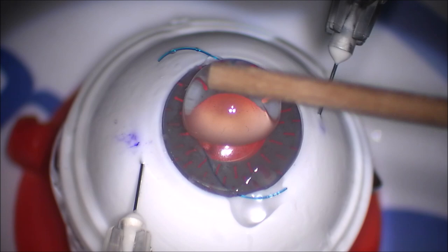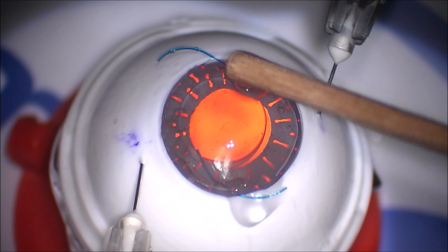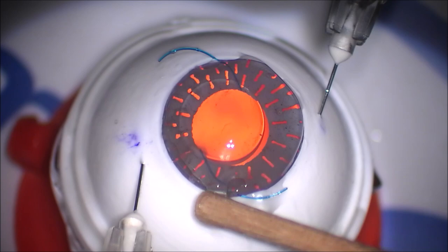And this corneal coating gel is just fantastic. It really creates a really clear view. It really gets rid of any reflections and glare. And so when you're doing these cases, I do think using the corneal coating gel is really quite helpful.